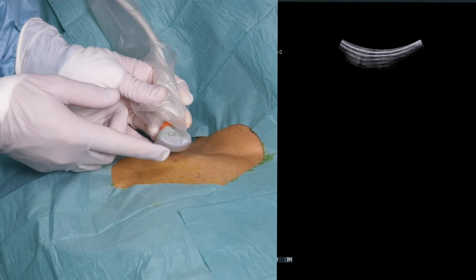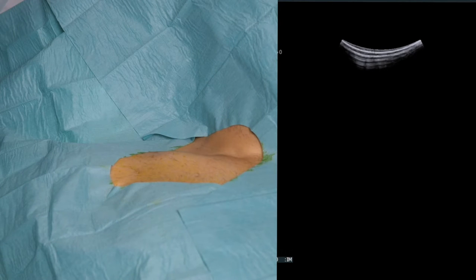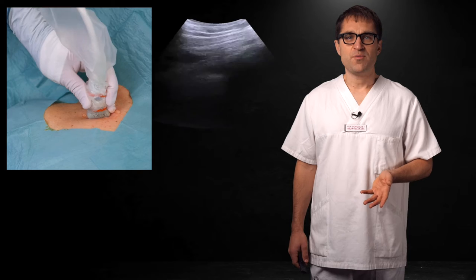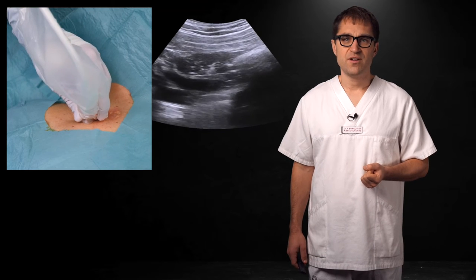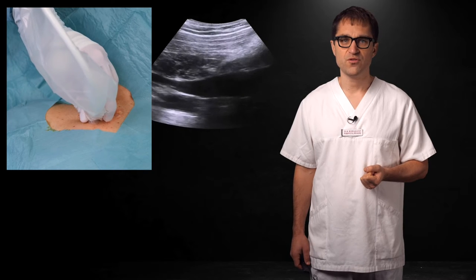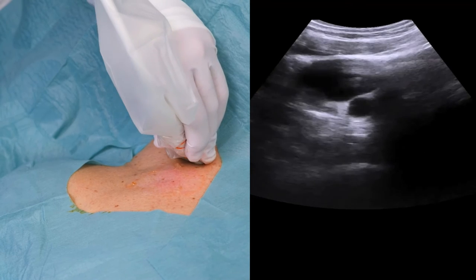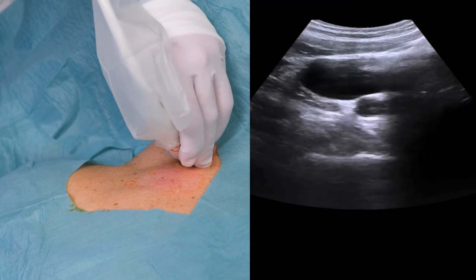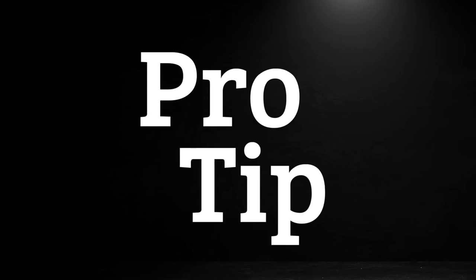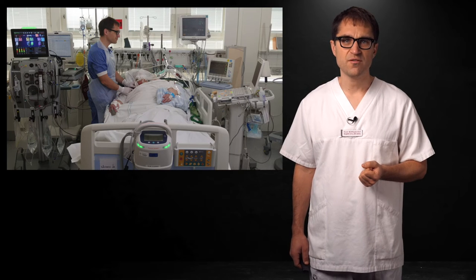It sounds basic and it is basic — just tap on the side of the probe to determine which side of the ultrasound screen it corresponds to. Always drape the patient to allow for both subclav and IJ access. To shift to the oblique approach, it's just a matter of moving the probe a few centimeters cranially and rotating it 45 degrees. Stay put by the side of the bed; there's no need to move up to the head of the bed. You can just as easily cannulate the IJ standing by the side of the bed if you use the oblique approach.